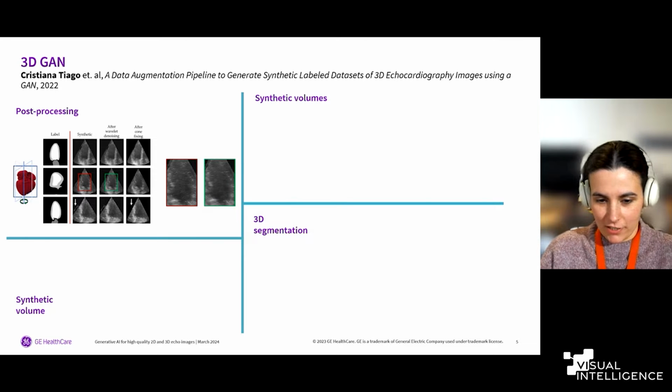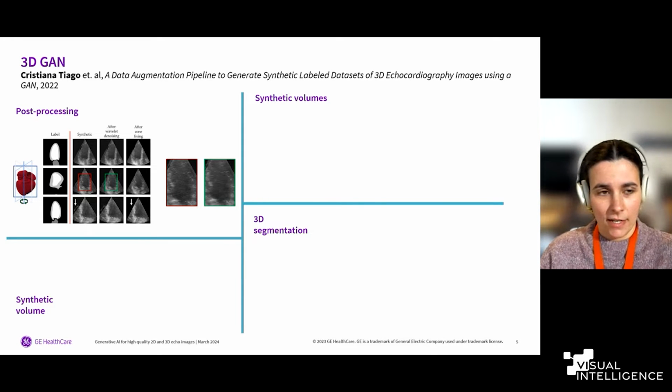It means that the network just learns how to generate one image that yields a very low loss and keeps generating that image over and over again. So there is no variability in the types of images that the model generates. So we had to account for that.